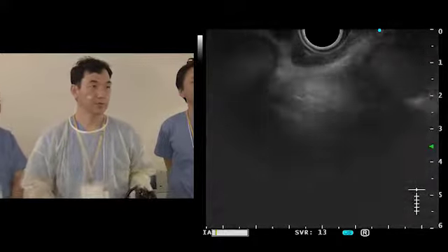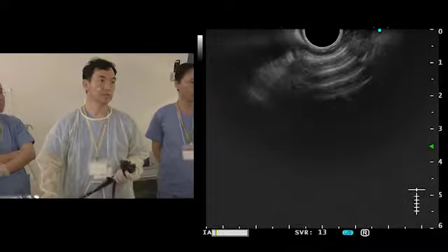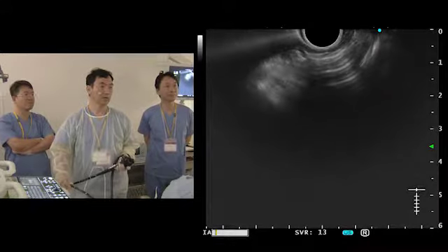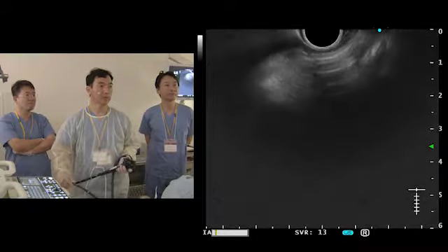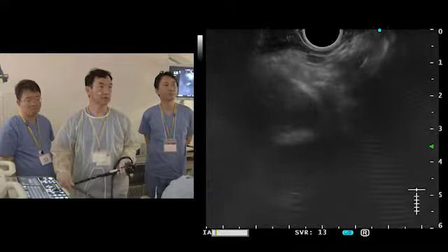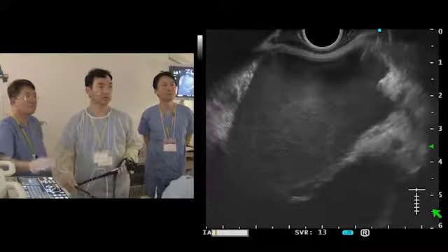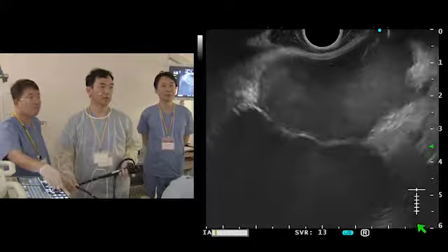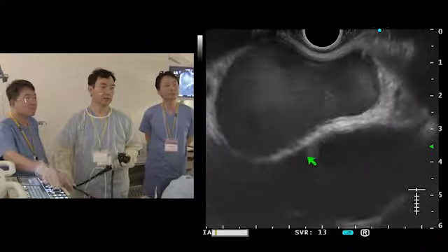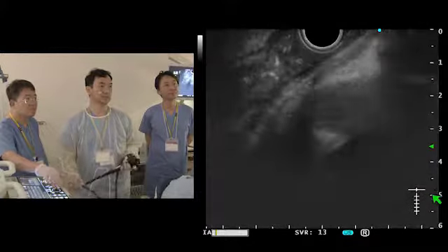Now I'll show you the endoscopic ultrasound image. The first thing you see is mostly the trachea. There's a strip of hyperechoic repetitive echo, and on the left side, this is the subcarinal space. If you push in, oh, thank you, Dr. Wong, you see the left atrium and a mitral valve. If you turn a little bit to the right, this is the aortic valve.